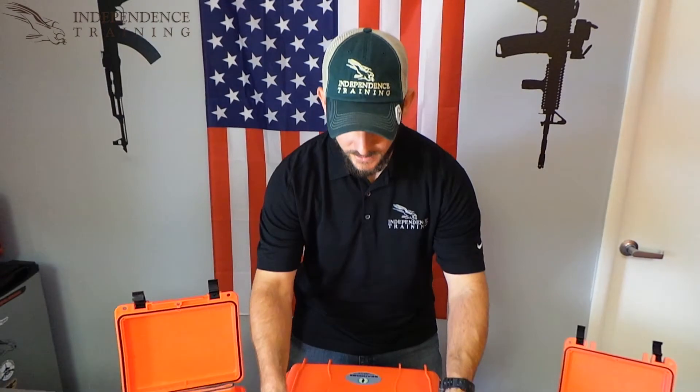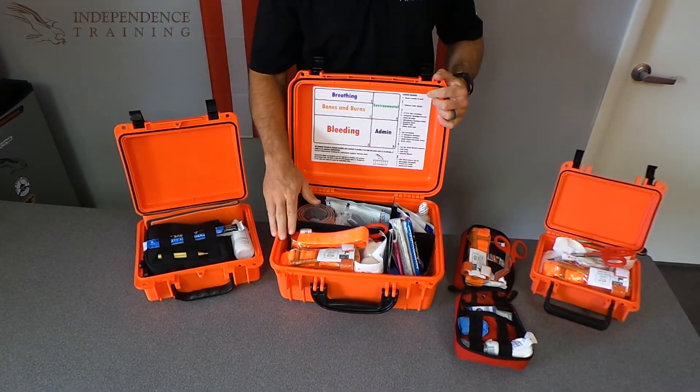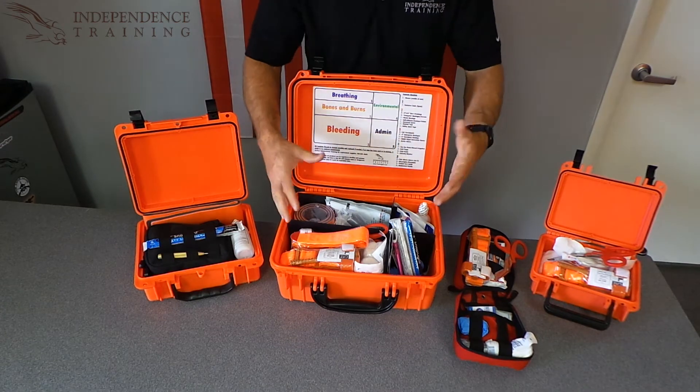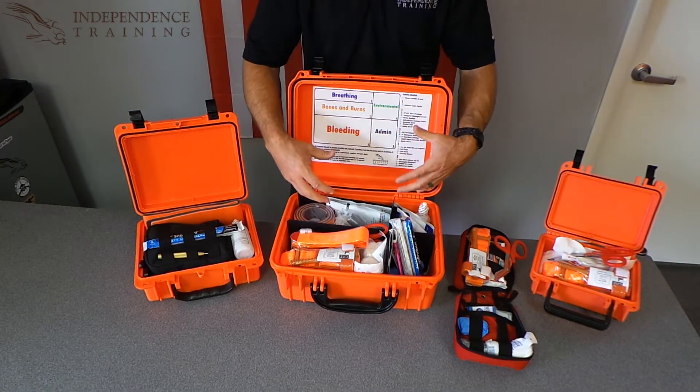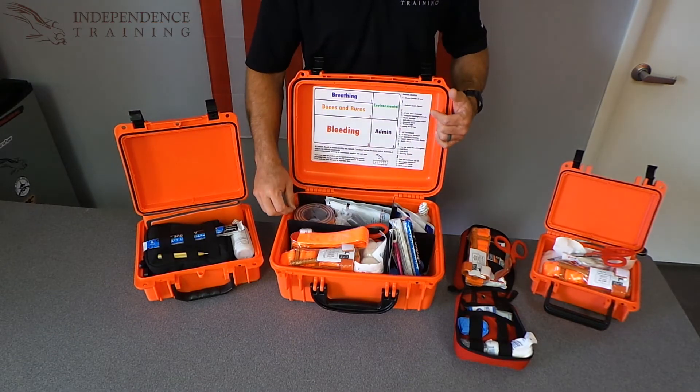So let's take a look at our MFAC. Now like our other kits, it is available in a Seahorse case — a nice waterproof, dustproof case. And as you've seen in our other kits as well, there's lots of available space in here for you to add what you need that's specific to your lifestyle.